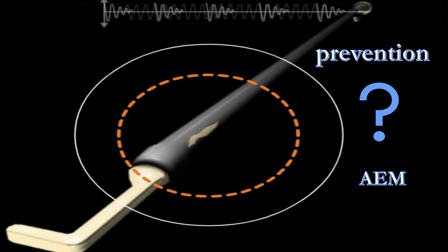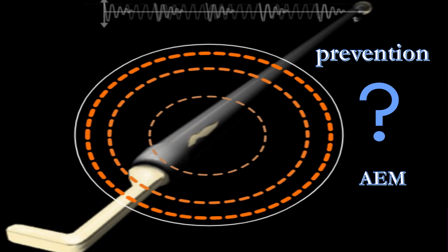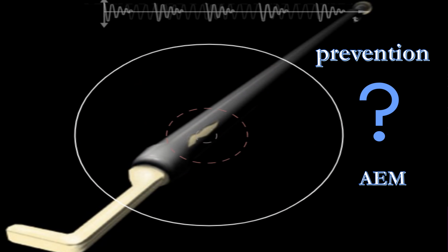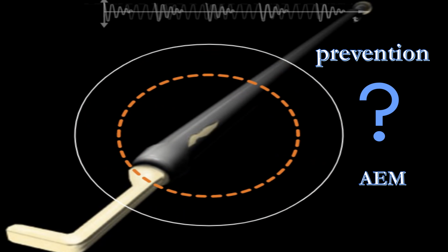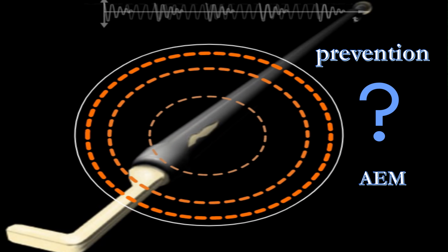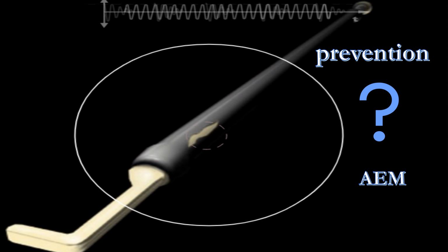Because it is difficult to visualize very thin holes with the naked eye, an active electrode with an indicator shaft was designed with two layers of insulation, a black outer layer and a yellow inner layer. The shaft is replaced as soon as the yellow layer is exposed, indicating an insulation defect. Active electrode monitoring, AEM, technology prevents stray current burn from insulation failure and capacitive coupling.